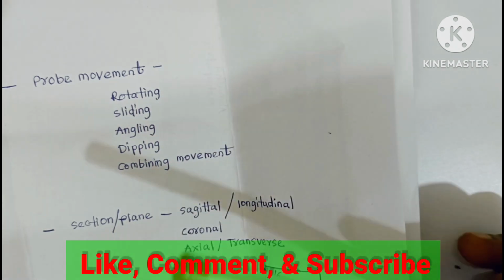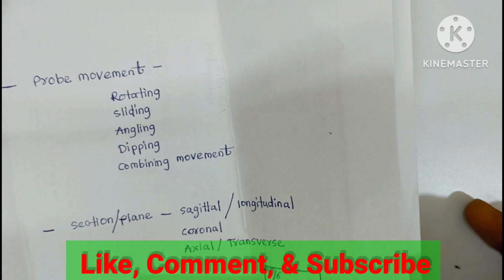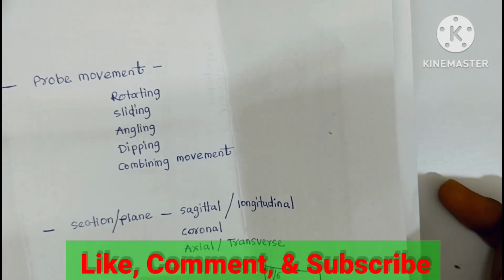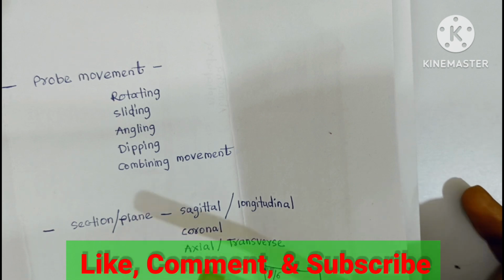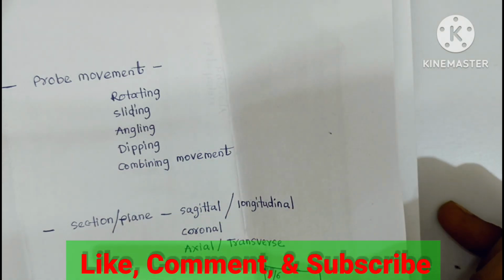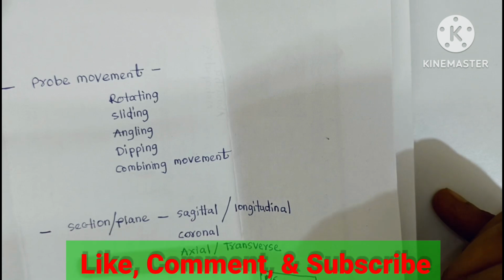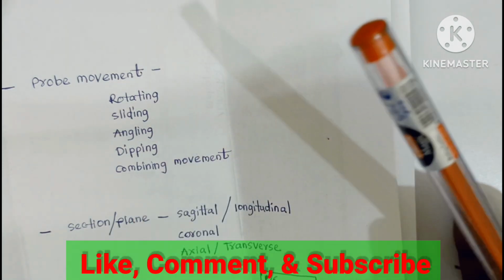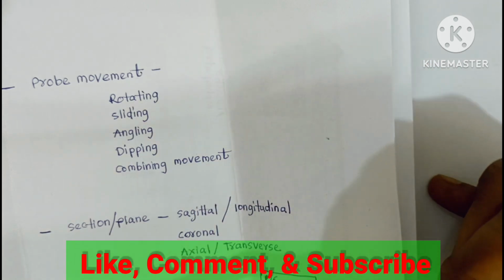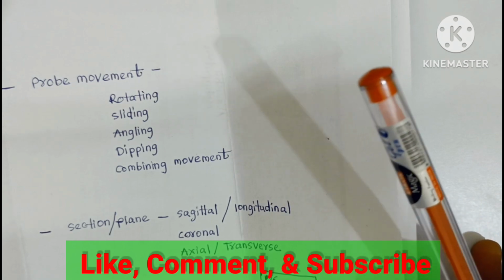What is the meaning of rotating movement? Rotation means clockwise direction and anti-clockwise direction. When we are taking a transverse view and move the probe towards the longitudinal view by clockwise movement, the transverse view becomes the longitudinal view. This is called clockwise rotation, and the other type is called anti-clockwise rotation. Remember, in transverse view, by clockwise rotation, it becomes longitudinal view.